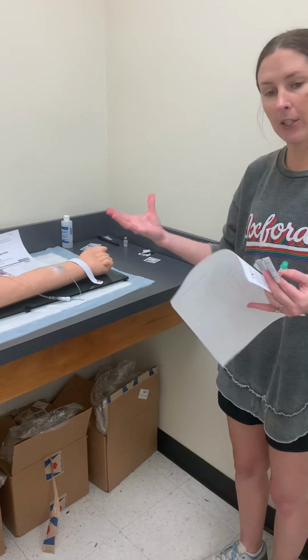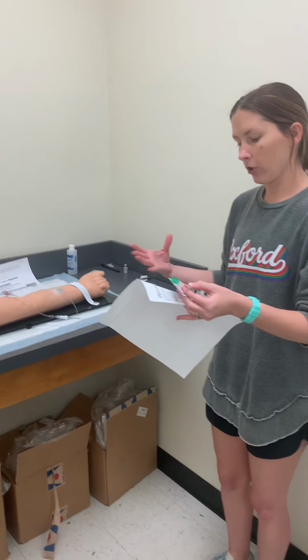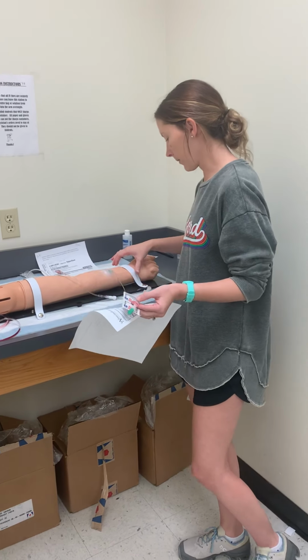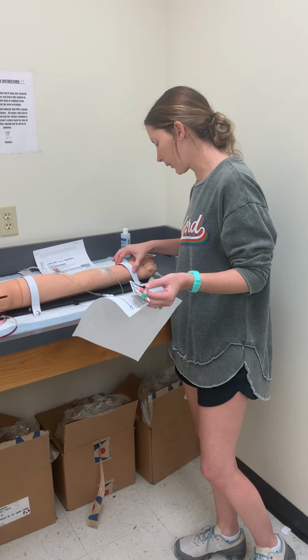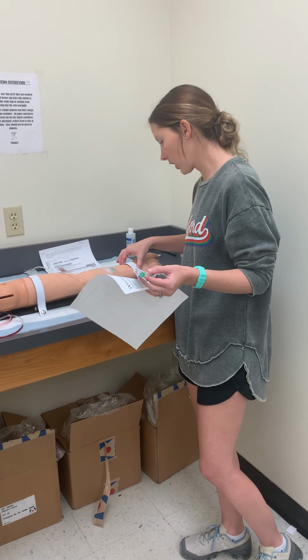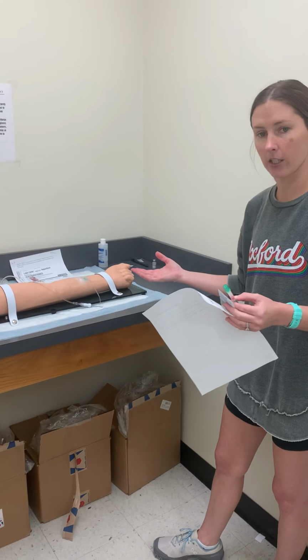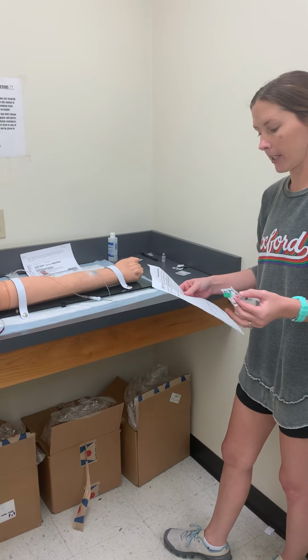Right, I am in my patient's room, and the first thing I want to do is ask, can you tell me your name and your date of birth? And as they tell me their name and date of birth, I'm comparing that with their armband as my 2 identifiers. I also want to ask my patient if they have any allergies, specifically to digoxin. And then I want to explain my procedure.